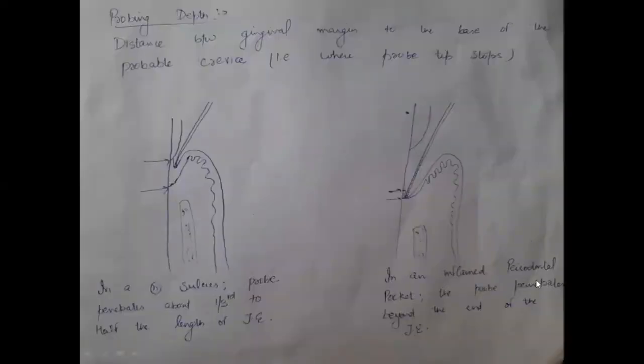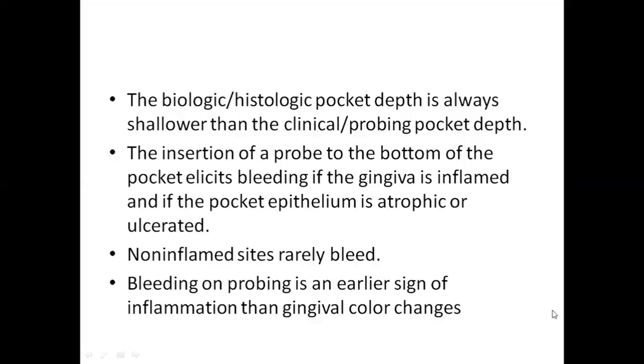Up to which depth a probe can penetrate into a periodontal pocket depends upon the type of inflammation, or the condition of the tissues.